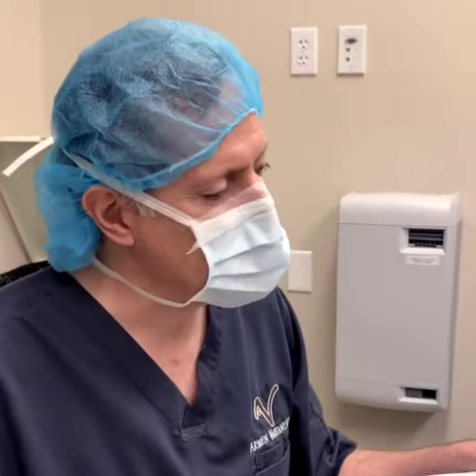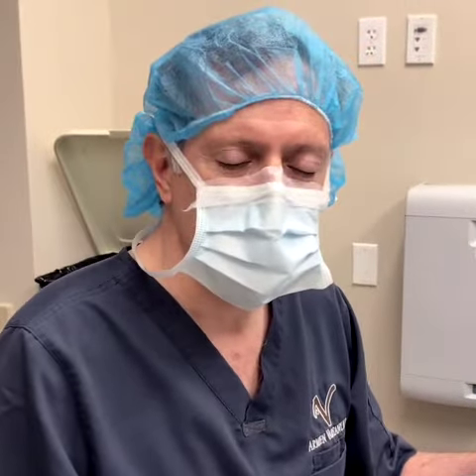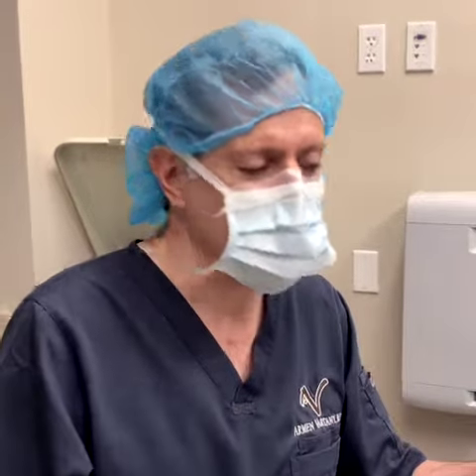Today we're doing a secondary or revision rhinoplasty. The patient had a rhinoplasty before and needs to have it again, and it's always a very difficult surgery when you have to do rhinoplasty a second time.